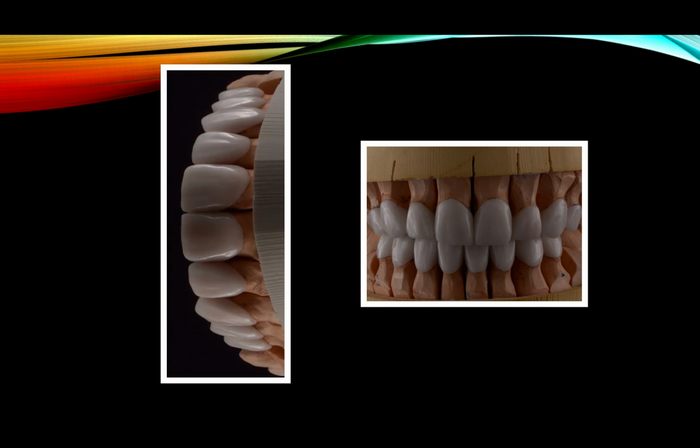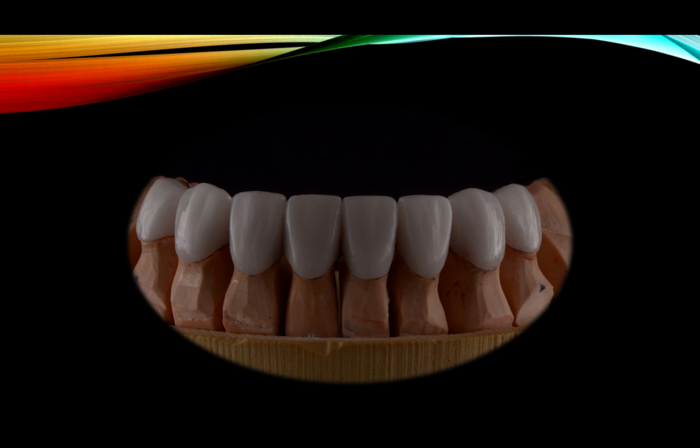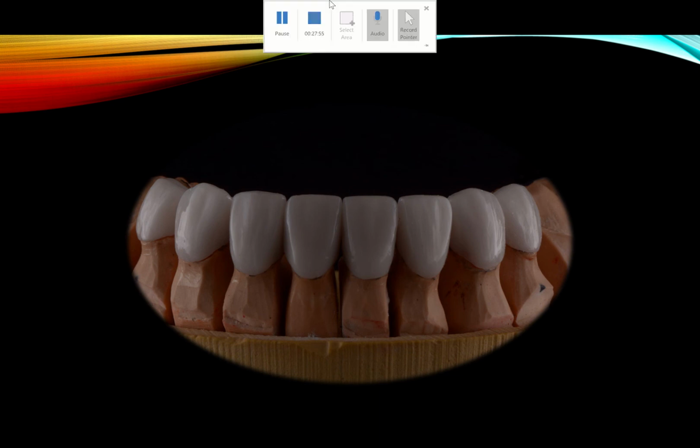On the white shades, there isn't much that you can do. In other words, it's a thin shell, thin buccal window technique preparation shell. All right, veneers or lumineers or whatever. Same thing on the lower. The same way you do the upper, you will have to do the lower.